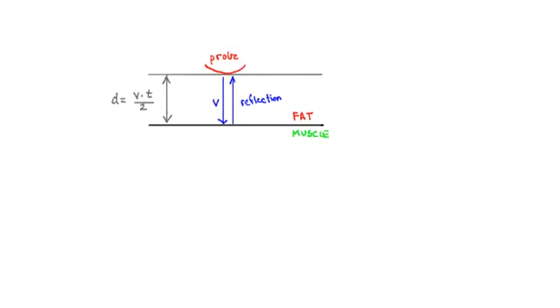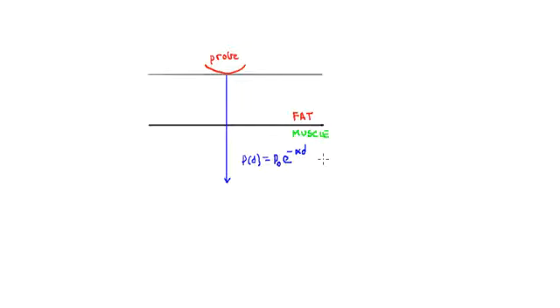Let's go back to this picture of the wave going in. You have this ultrasound wave propagating down into tissue, and as it does, it's attenuated, so the pressure differences become less and less the deeper you go. I can write an equation for that. You can imagine what it is. You start with some pressure at the top. It's e to the minus alpha d, okay?